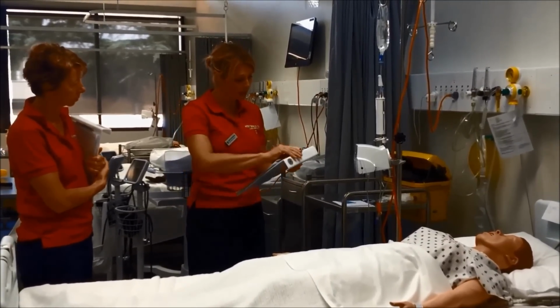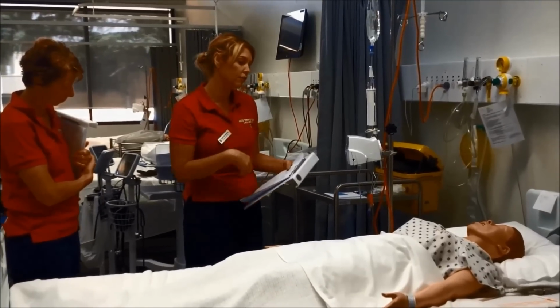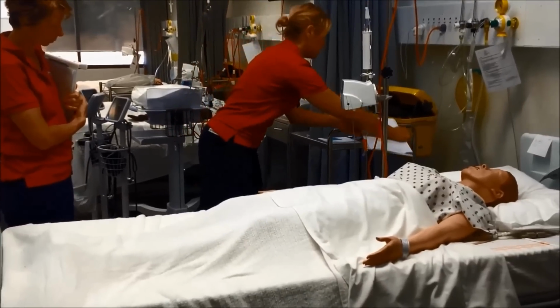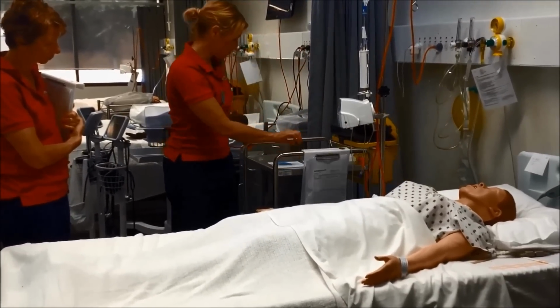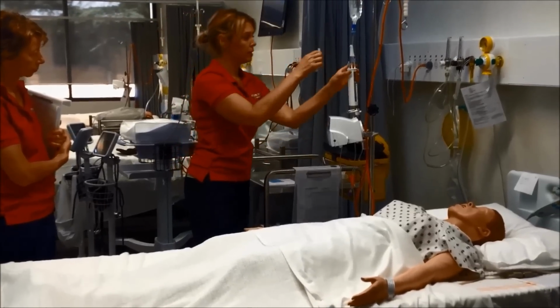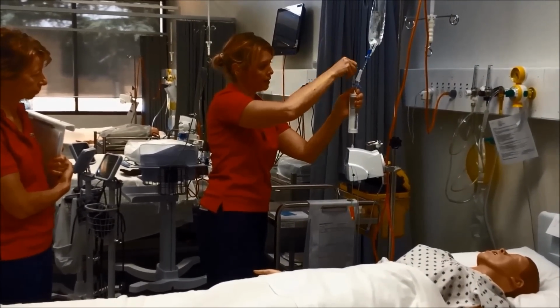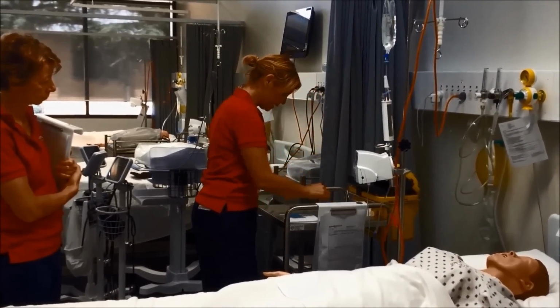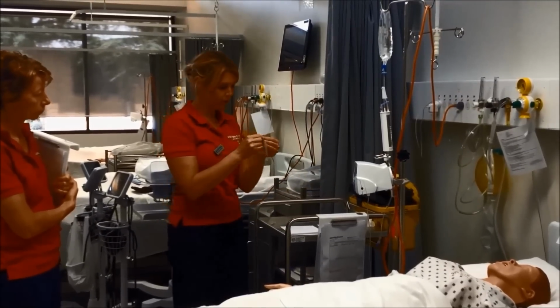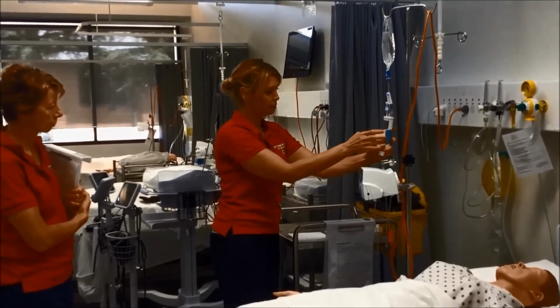I'm just about to start your gentamicin. It's got a few different things. We're putting it through a pump so that you don't have any adverse side effects, but you might feel a little bit of nausea and get a funny taste in your mouth. So let us know if that happens. Okay, I'm just going to put my drug into the burette. So I'm going to unscrew, screw, put it in. Give it a shake. Now that it's in, I'm going to put the label on, which you've checked. Okay, label's on.